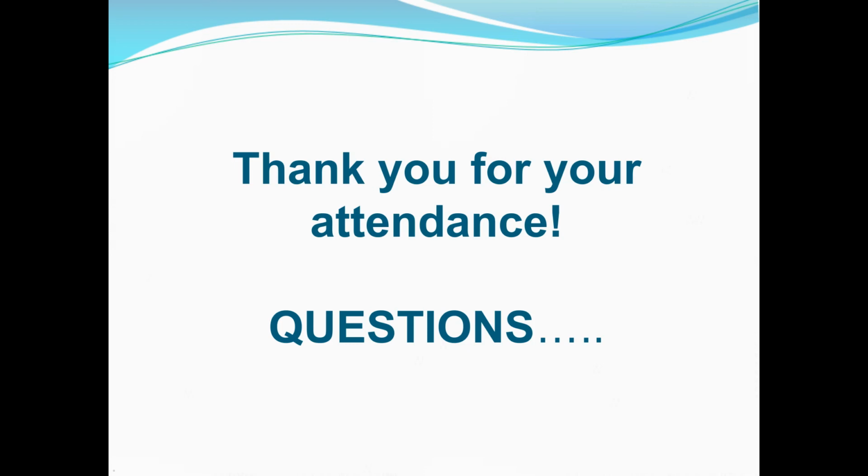This one says, do you have any suggestions to provide a laboratory just starting the validation process for CA Sepsityper? Suggestions. It's hard to say. I guess it would be whatever works for you. We gathered the organisms that we wanted to see if it was going to identify them, and then we had multiple technologists work on it so that we knew different people would be able to use this. We didn't want it to be just one certain technologist doing it.